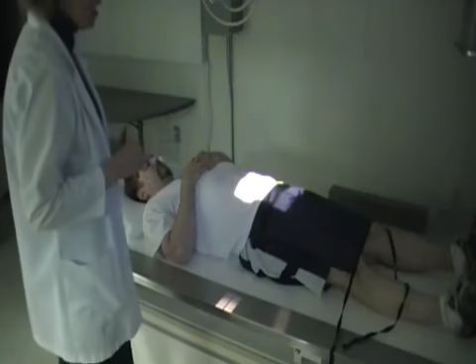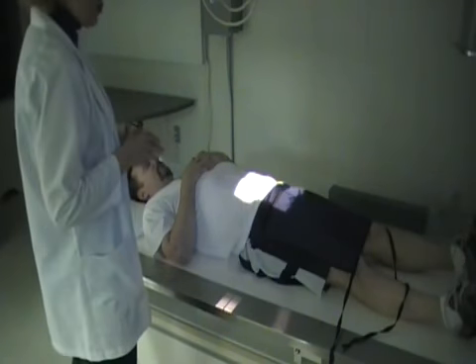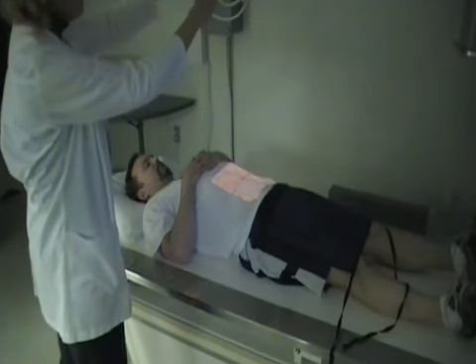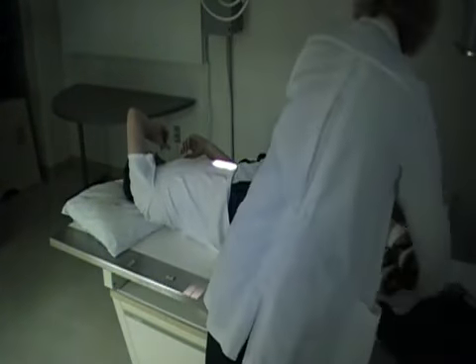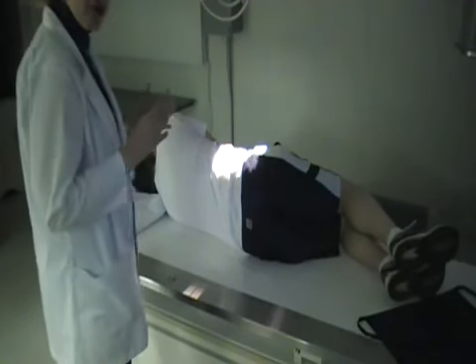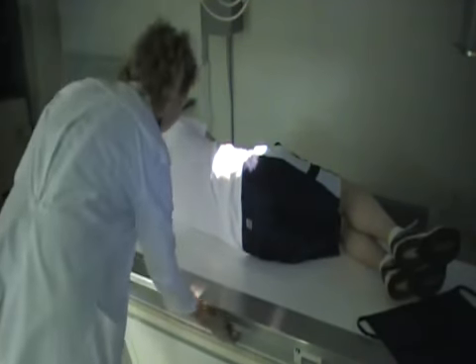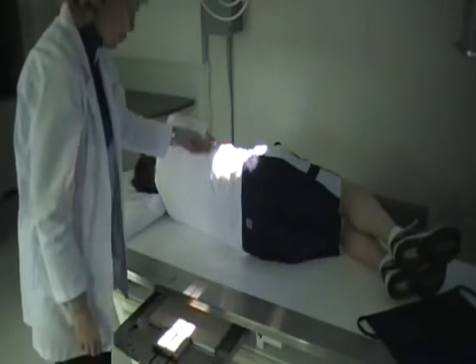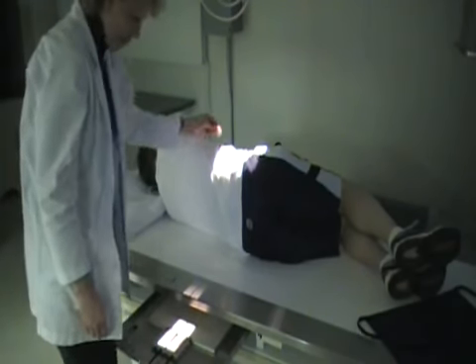To do the lateral, oftentimes the physician just likes a combined image for the sacrum and coccyx. I'm going to show you the combined as well as separate images. This is a straight central ray. The patient is going to lay on the left side. Now, there's nothing wrong with doing a right lateral, but it's hard to see where you're going in at, so that's why the left lateral is preferred. Okay, so adjust your bucky tray since we straightened it back out. Patient is on their left side, so you can place your marker on the image receptor, or if you wanted to, place it up here on the patient.